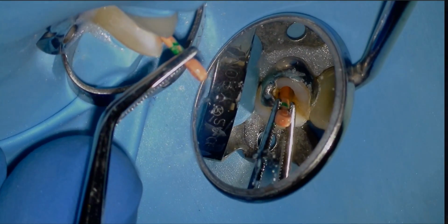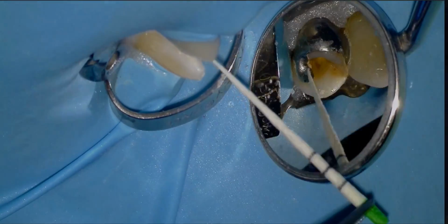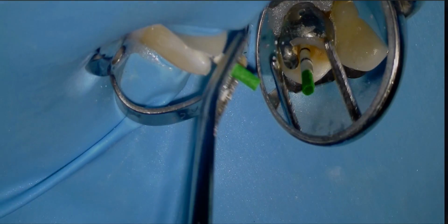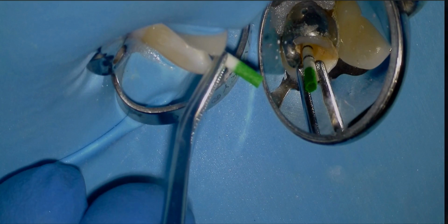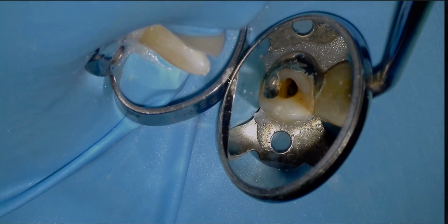And then when I go to place my cone back, I know exactly where it is if it's at length. So I'm going to fit both canals, and then we're going to dry with paper points. I am using a paper point technique. There's a video online that I put up about how to use this to ensure that you're at entire working length. Take a look at it there.